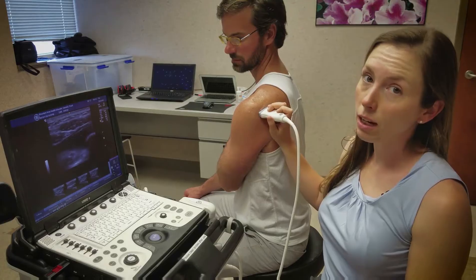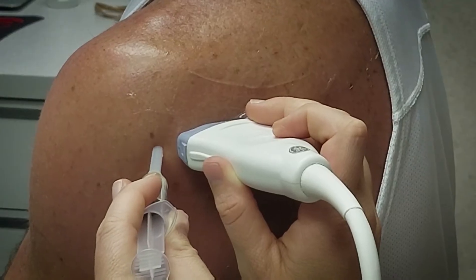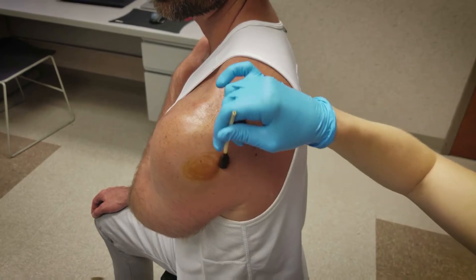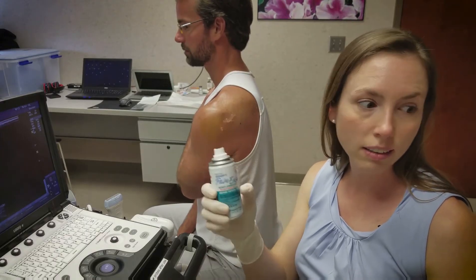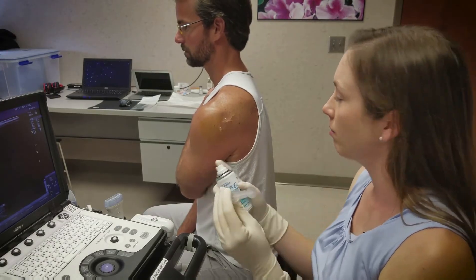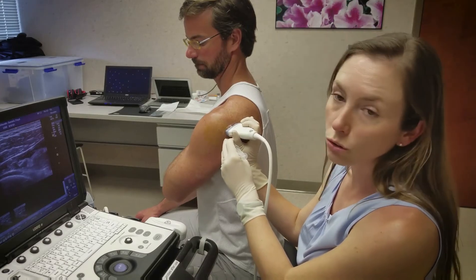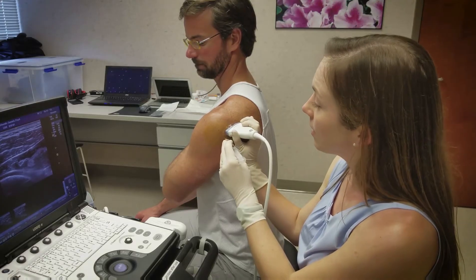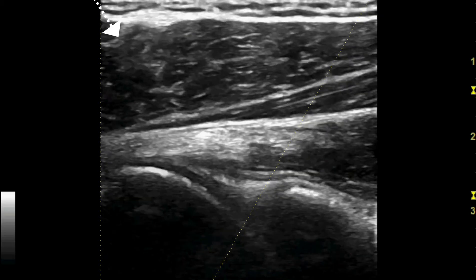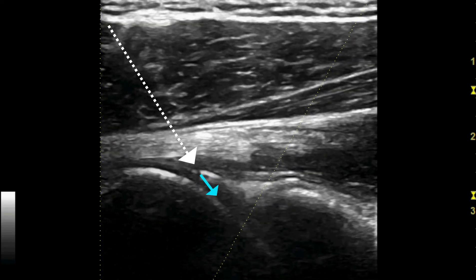After identifying your anatomical landmarks, mark the insertion site for the needle at the lateral edge of the probe. Clean with betadine three times. Employing sterile technique, apply the cold spray and advance the needle superficially into the skin. The needle is introduced posterolaterally and advanced in the anteromedial direction in line with the ultrasound. Avoid injecting into the labrum or the tendon sheath — you want to inject directly into the joint space.